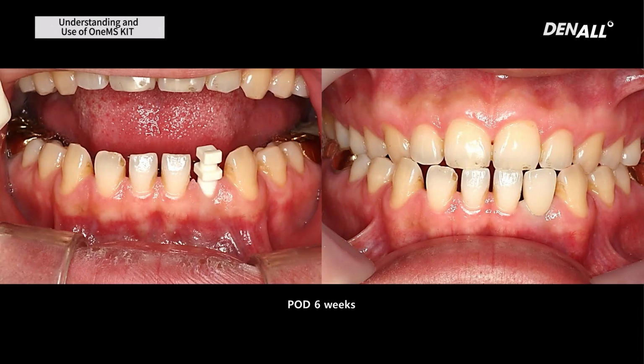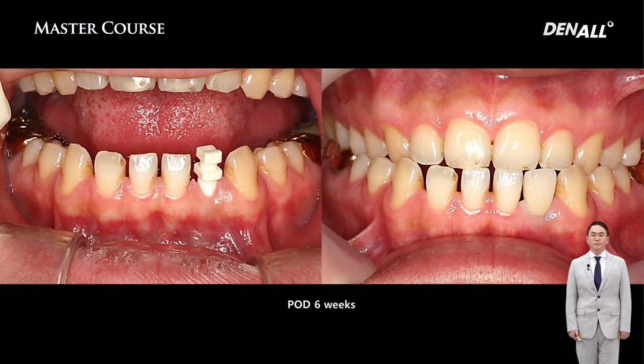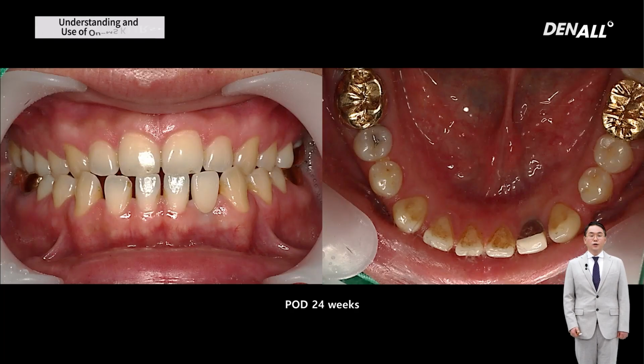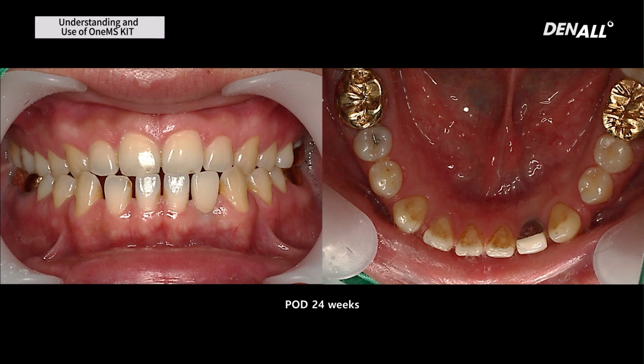After about 6 to 8 weeks, the impression can be taken using a specialized impression plastic cap. So the impression can be taken using that and a clip-on type abutment connection. So the prosthetic procedure becomes very simple. The final prosthesis is fabricated, and this is after the delivery. Long-term follow-up, post-op 24 weeks, the clinical photo shows no gingival recession. It is very well maintained.